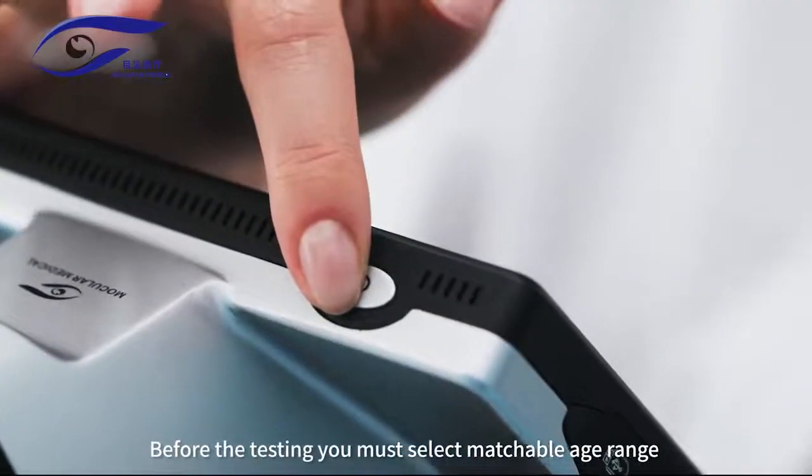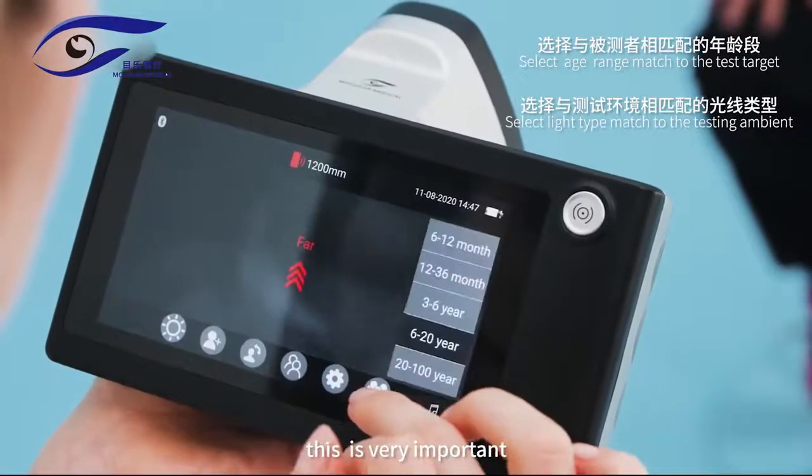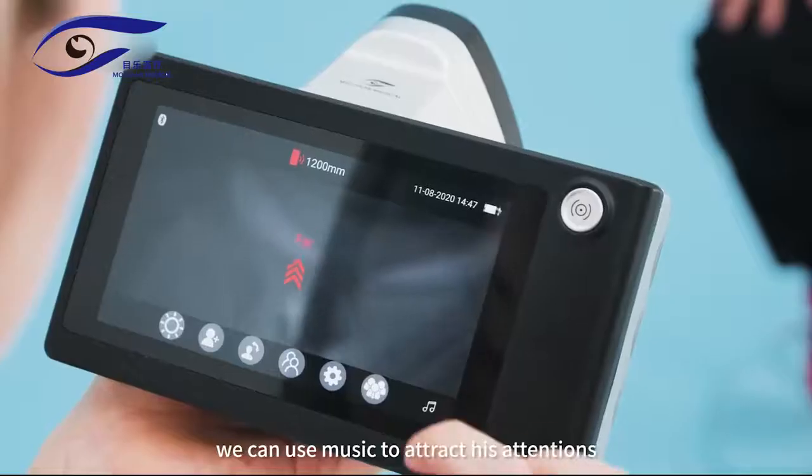Before the testing, you must select the appropriate age range and ambient light type first. This is very important, otherwise the result will not be correct. If the test target is an infant, we can use music to attract his attention.